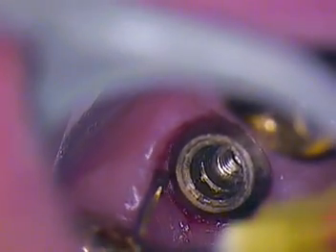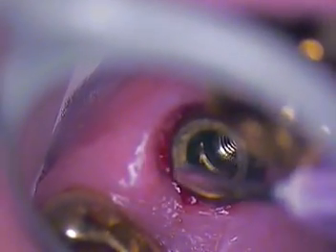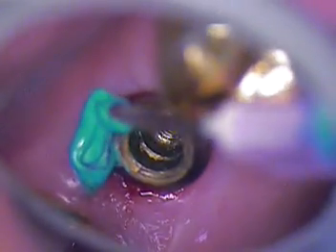Yeah, I'm going to use a product. What's the name of that product, Jen? Hemistil? Hemistil. What company is it from? Kerr. Okay. And we're going to use a little bit of this Kerr company material. And we'll squeeze some of that out. Okay. Got it. And we just want to quiet this area a little bit. So this is a special conditioner.